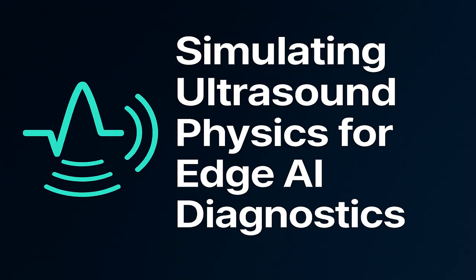Because they're able to generate a massive amount of backscatter from those tiny structures. A massive amount. Yeah. But of course, those waves also attenuate extremely quickly because of that 0.5 dB/cm/MHz rule, so their penetration is very limited. So having suffered this massive decay and scattering, the weak signal finally arrives back at the array of transducer elements, often barely distinguishable from the electronic noise.